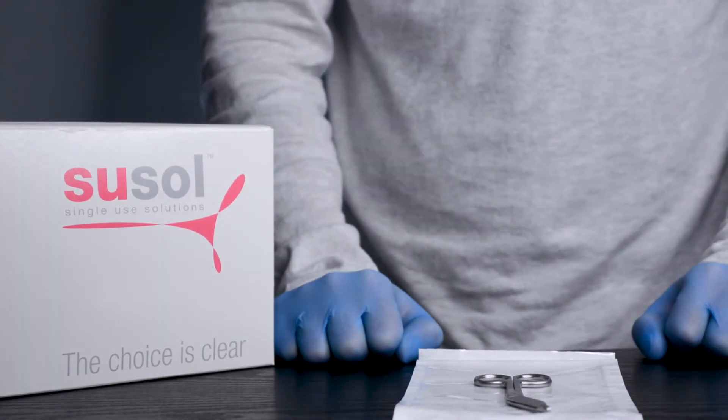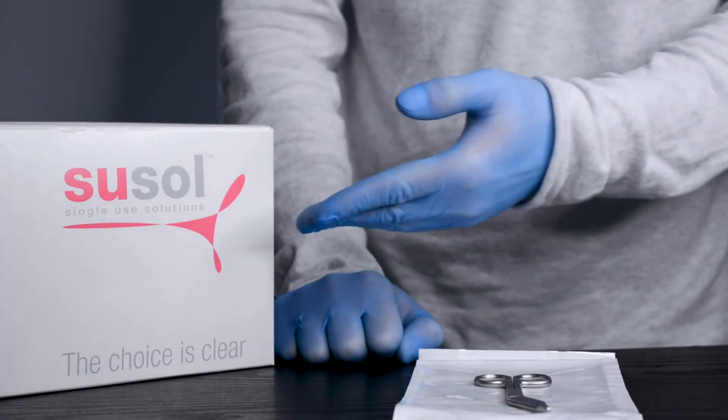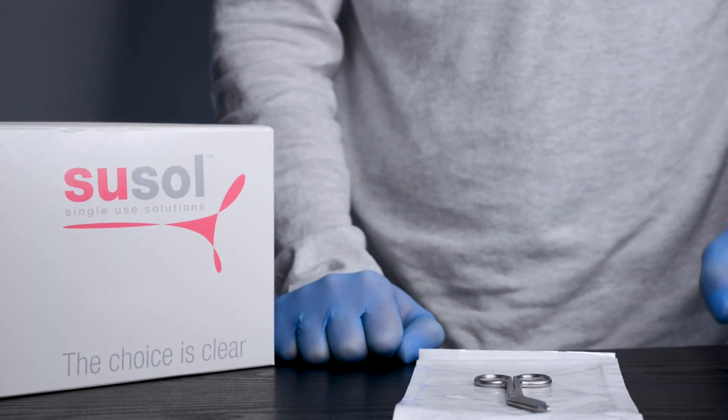We hold UK stocks available for quick delivery. Baby Instruments is a compliant supplier to the NHS on the national framework.